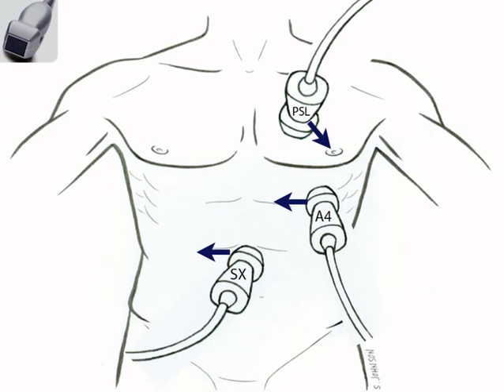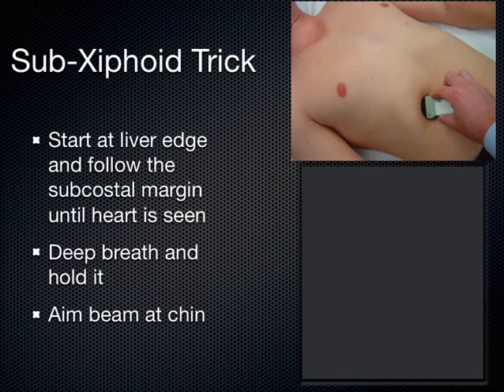And we'll start with that subxiphoid view. The interesting thing about the subxiphoid view, it's probably the one that people reach for first. Certainly the one that I reach for first when I've got a patient in shock. Just want to see if their heart is moving or not. Kind of what's going on with their, in the setting of a code, is the heart moving? This is the first sort of view I get.